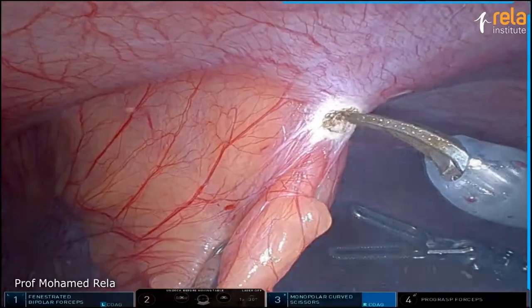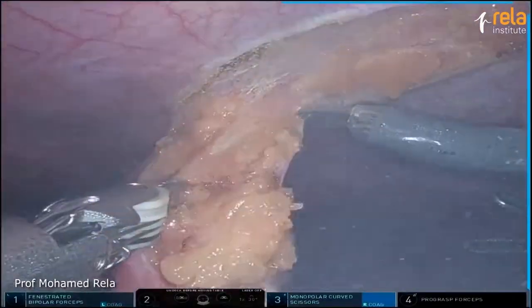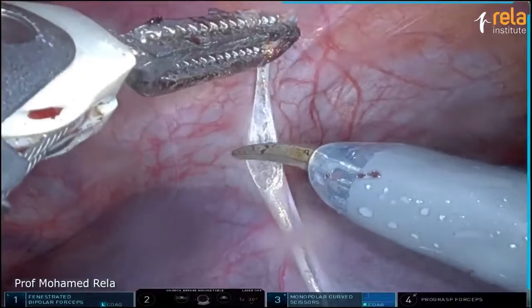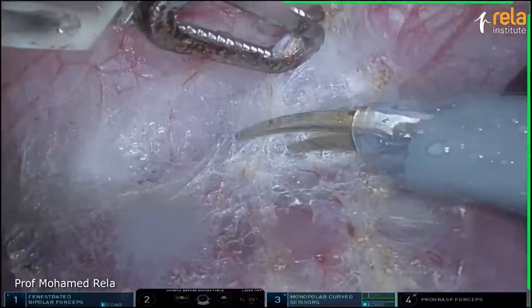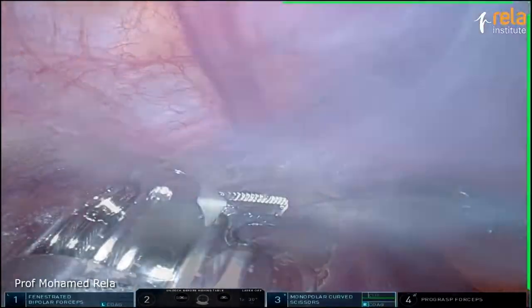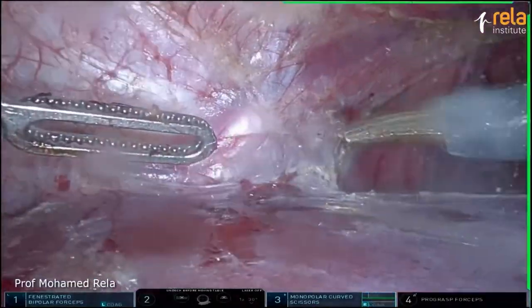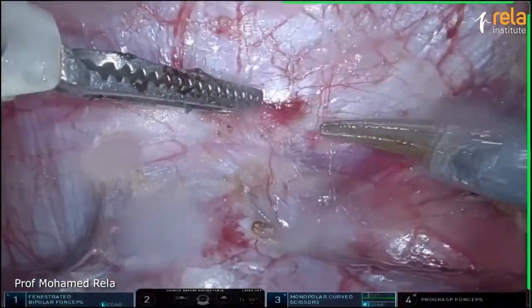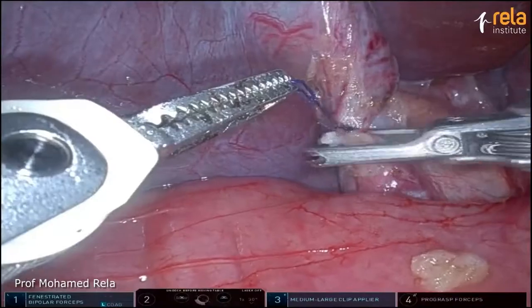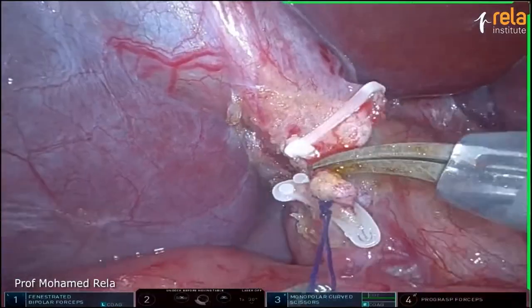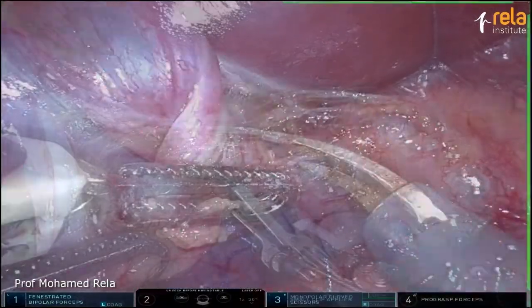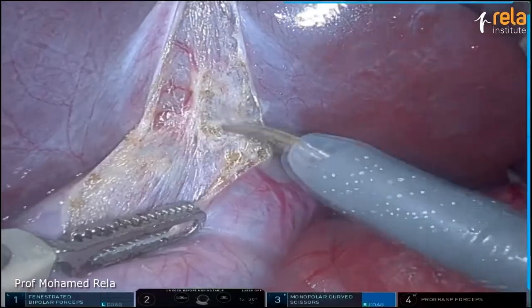This is a video lecture. The first video is a left-sided graft. You can see the falciform ligament is excised. Now we're dividing the left triangular ligament and the left lateral segment is completely mobilized. A cholecystectomy is being performed — the cystic duct is being divided, the cystic artery is being divided, and the cholecystectomy is being completed.